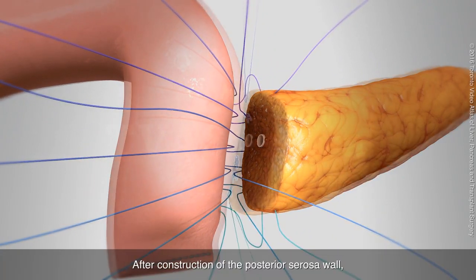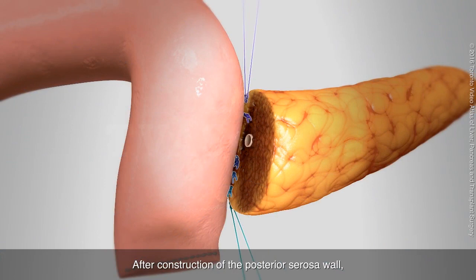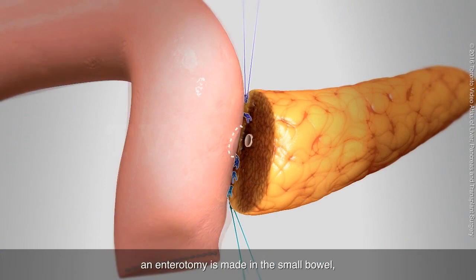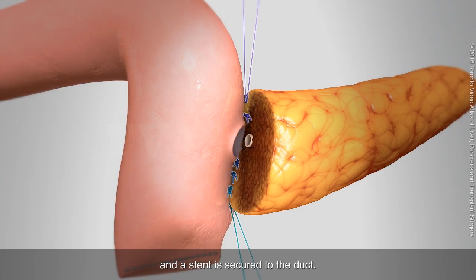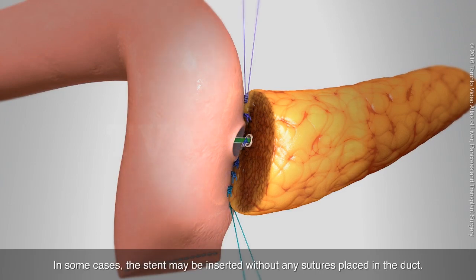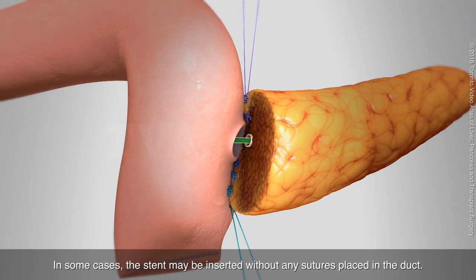After construction of the posterior serosa wall, an enterotomy is made in the small bowel, and a stent is secured to the duct. In some cases, the stent may be inserted without any sutures placed in the duct.